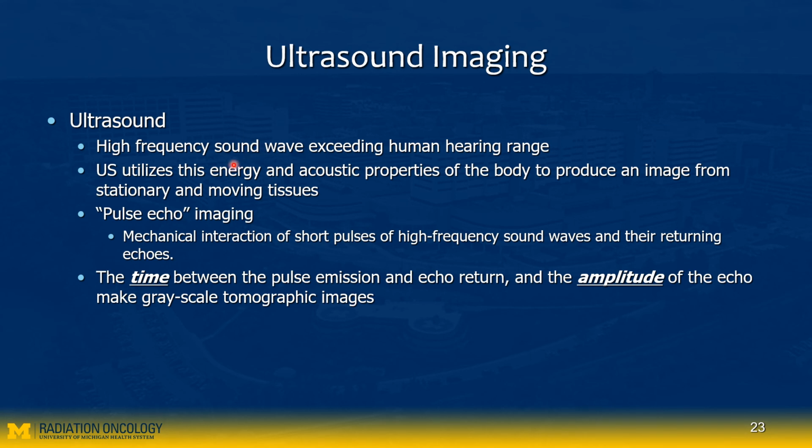Okay, let's move on to our next topic, ultrasound imaging. Ultrasound imaging has nothing to do with X-ray. It is actually a mechanical way of acquiring images using sound. However, we have some use for it in our department or in our field, so I believe it's worth learning about ultrasound.